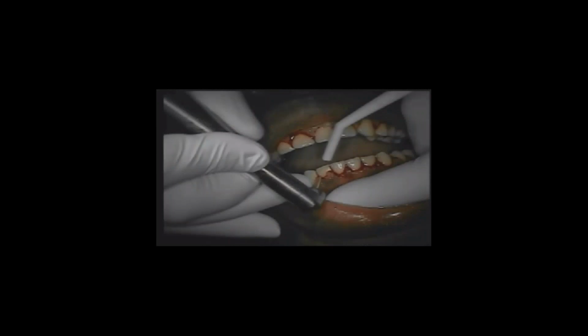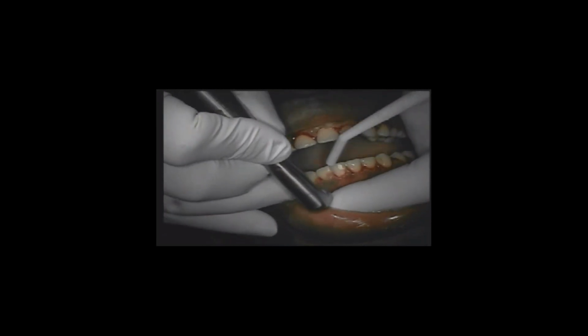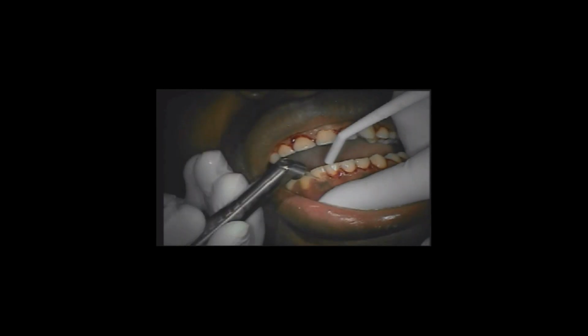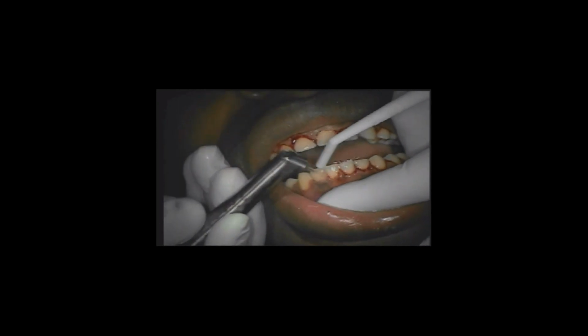So two things: a low energy setting and keeping that tip at an angle where we're creating a bevel will pretty much negate any issue with hurting that enamel. To effectively cut enamel, I typically start with about 4 watts of energy to do anything much with enamel. So again, we're at only about 1.8.